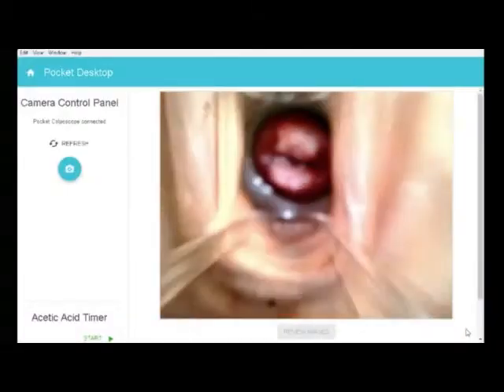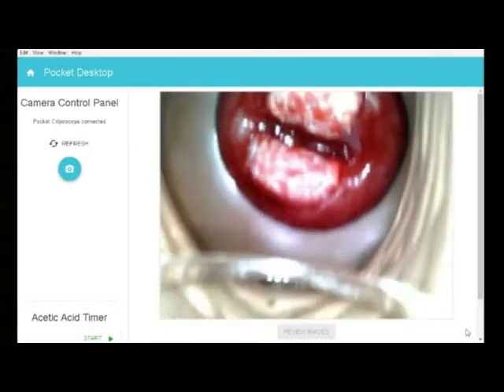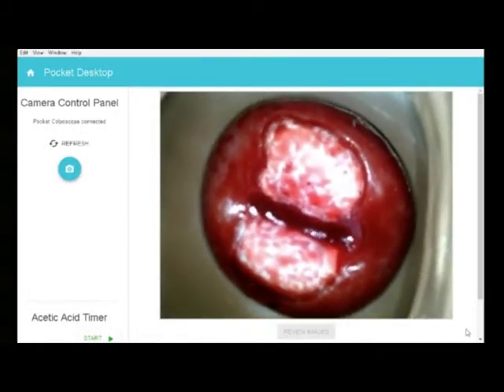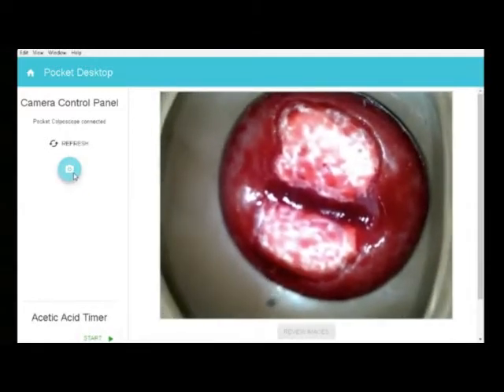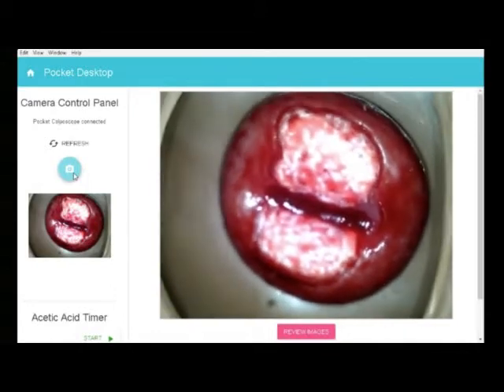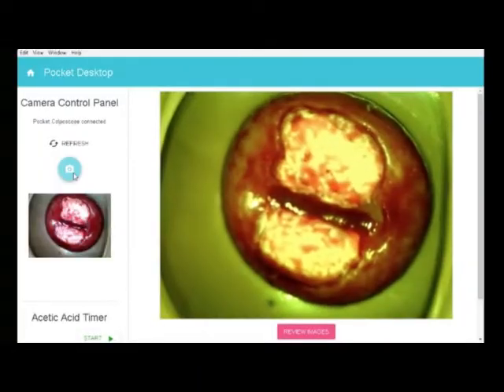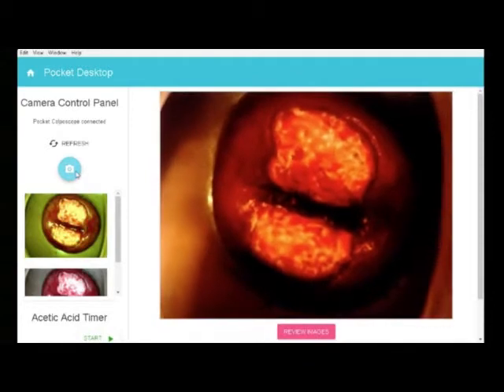Slide the probe along the speculum until the probe tip is approximately 3 centimeters or 1 inch from the cervix. Adjust the probe to ensure that the whole cervix is visible and press the light toggle button if necessary to adjust the light settings. Capture images by pressing the camera button in the camera control panel on the software, or, if you have the latest version of the software, by using the shutter button on the pocket colposcope. By switching the light settings and again pressing the camera button, different types of images can be captured.